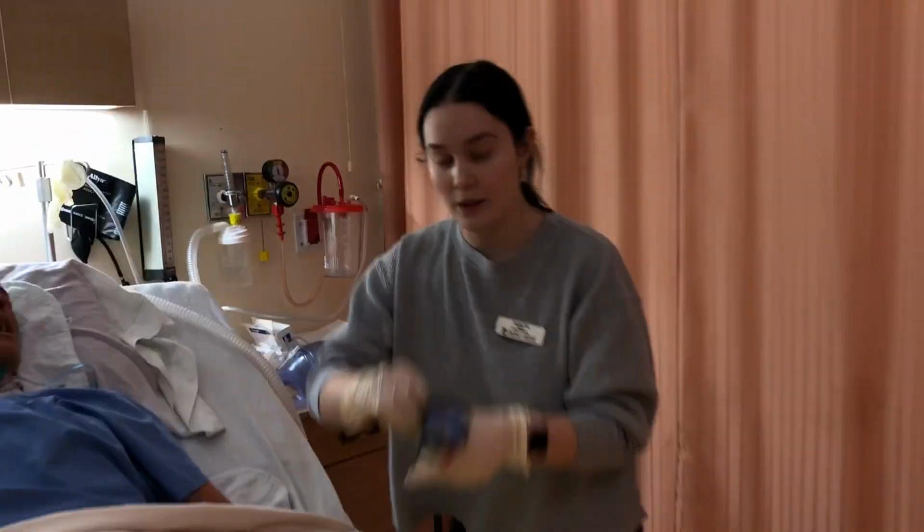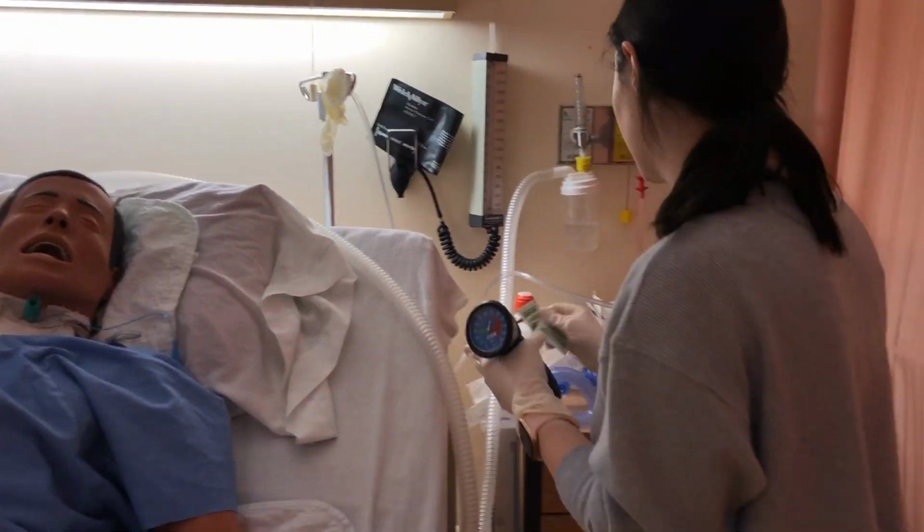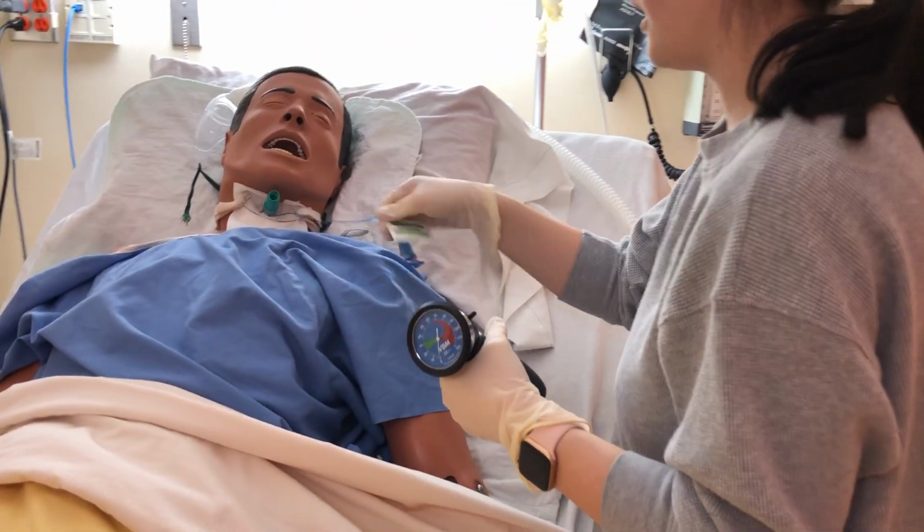Okay, thank you. So I'm swabbing this part with alcohol, and then I'm also going to be swabbing where I'm checking for the cuff pressure.